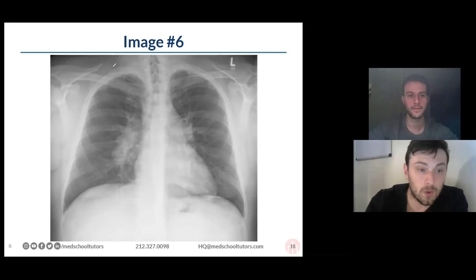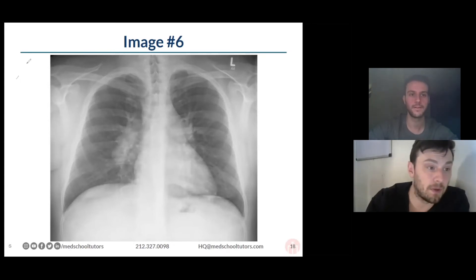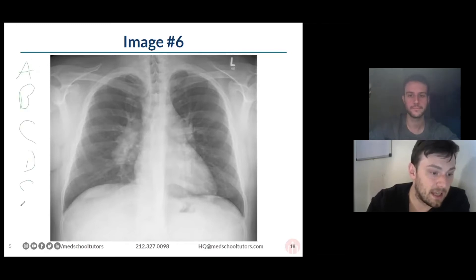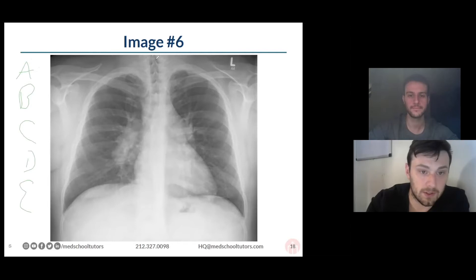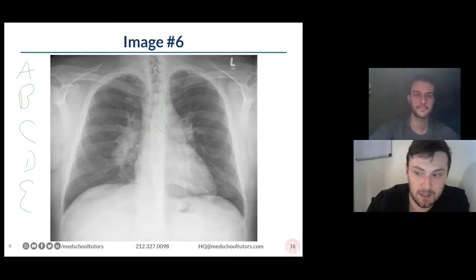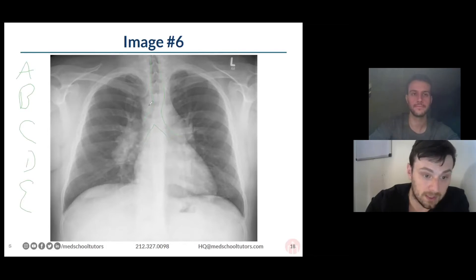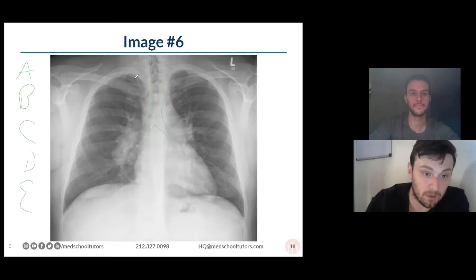Just a reminder of how to go through your classic chest X-ray. There are a bunch of different reading systems — ABCDE was always the one I was taught. You start with your airway — here's your airway, here's your carina right here. B can stand for a couple different things: it can stand for bones, or it can stand for breath.